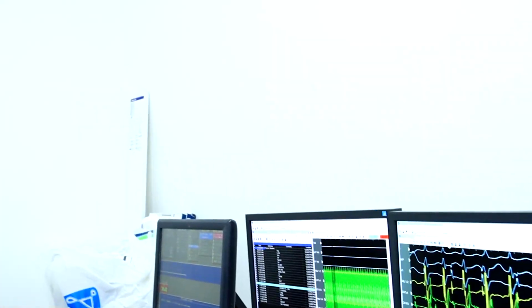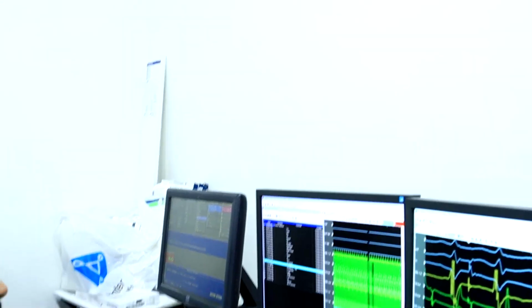So the clue was, how about if we pace the left ventricle and map or induce the tachycardia from the left ventricle? We were able to introduce the quadripolar catheter inside the CS tributary, and we advanced it, and we were able to capture LV via the tip of the quadripolar catheter. We get the shortest VA time on distal ablation.